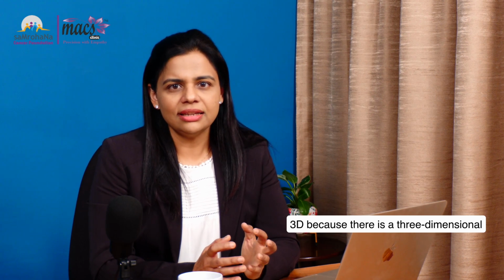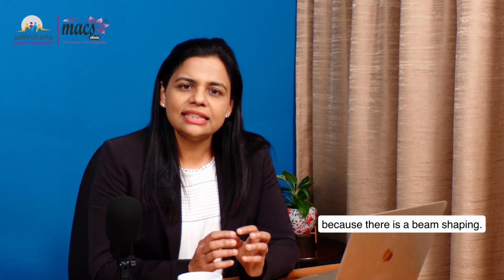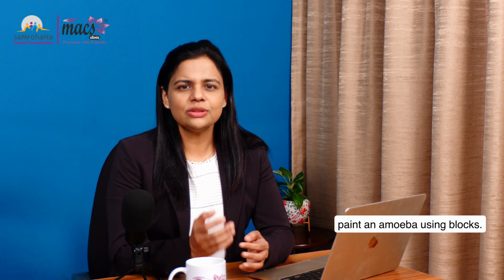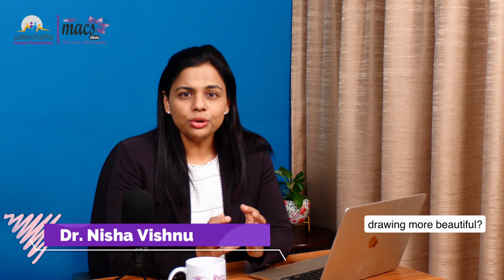3D because there is three-dimensional imaging, and conformal because there is beam shaping. The problem with this is that when we use shaping and blocking methods, we cannot attain very irregular beam shapes. It's like asking a kid to paint an amoeba using blocks. How do we make the drawing more beautiful? By replacing the blocks with a paintbrush.